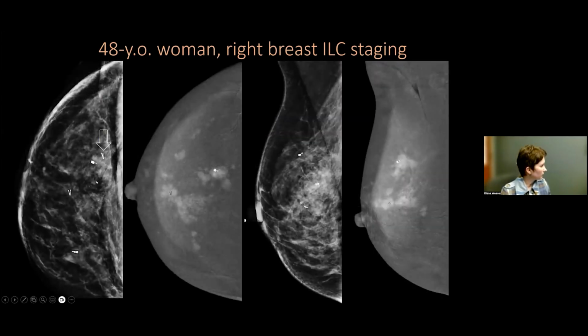So on the left, these are our new biopsy clips. These are the pre-existing, these are new biopsy clips. Obviously, right after the biopsy, the positioning is a little off, but it's still pretty close to the extent of disease in a transverse plane we expected to find.